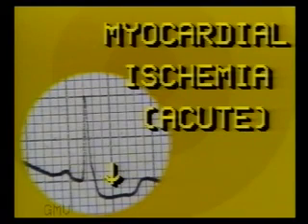What happens is that after exercise, the myocardial demand increases, but sufficient blood cannot reach the myocardium due to partially obstructed coronary arteries. So there is acute myocardial ischemia seen on the ECG in the form of ST segment depression, which disappears with rest when the demand reduces.